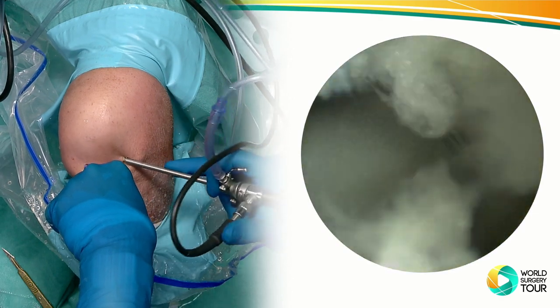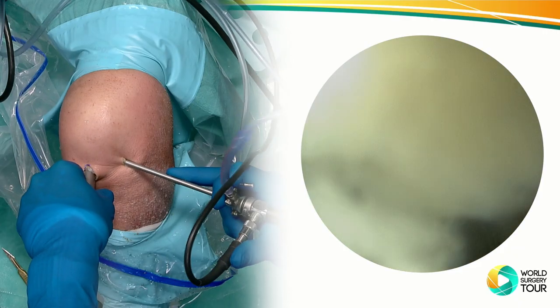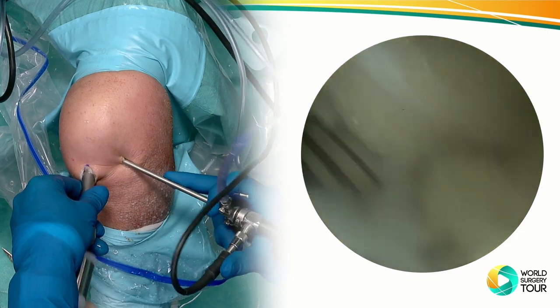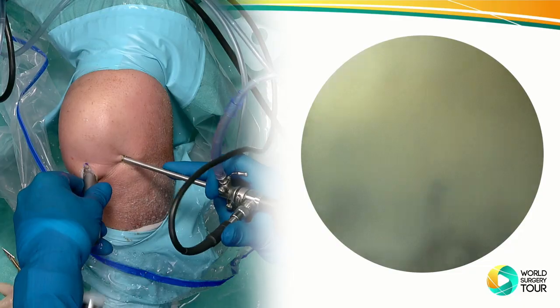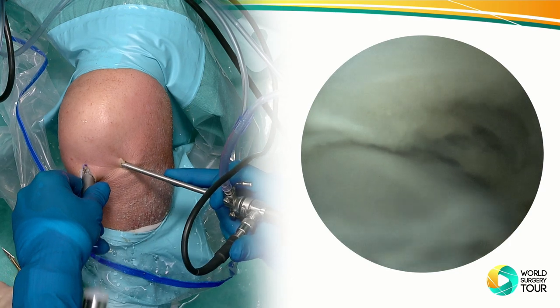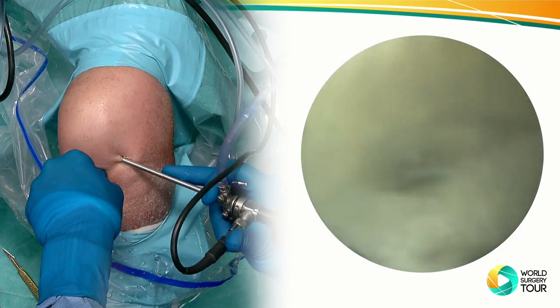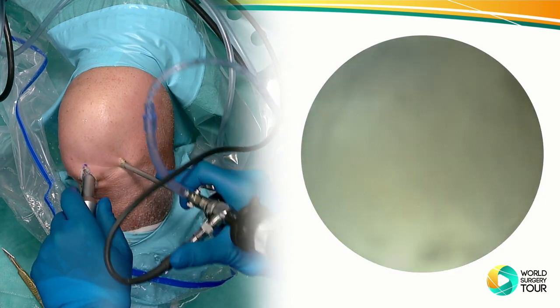Right. Let's see that. Still some tissue there. The window comes. There is the window. There we go. Okay, perfect. Now punch it in. More. Yep. Okay, let me see. I'm not sure. Okay, could be good. Let's take a shaver blade.